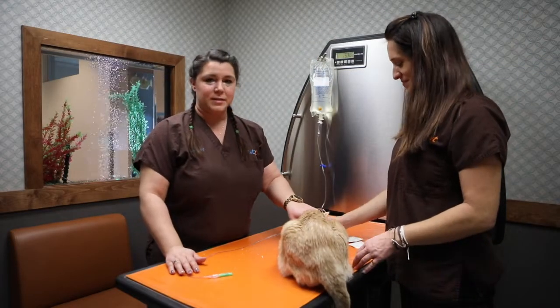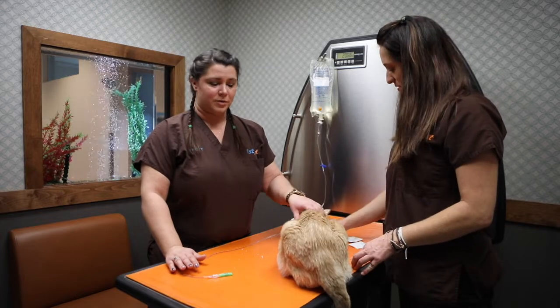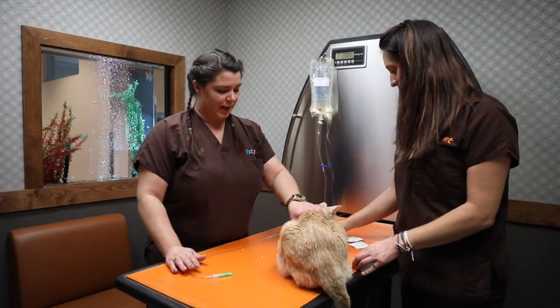This is Basil, and today we're going to be going over how to administer sub-Q fluids to a cat.